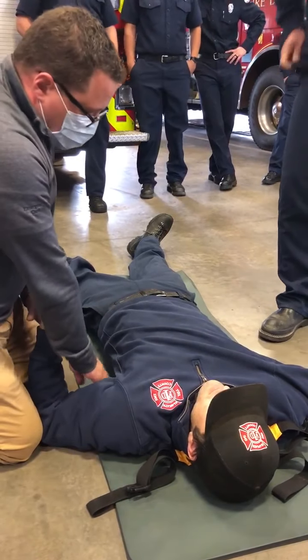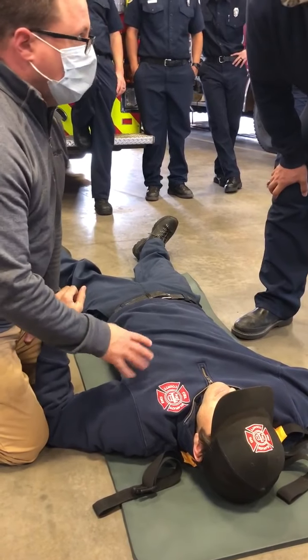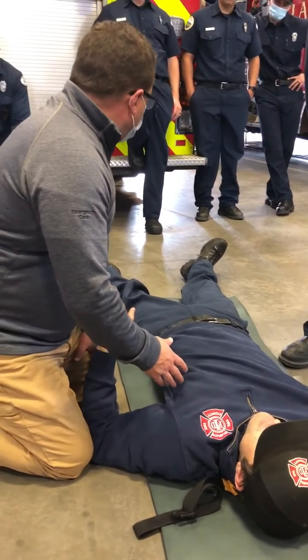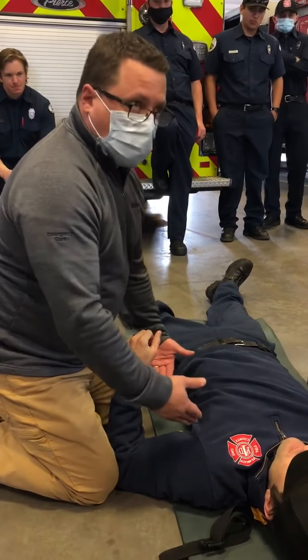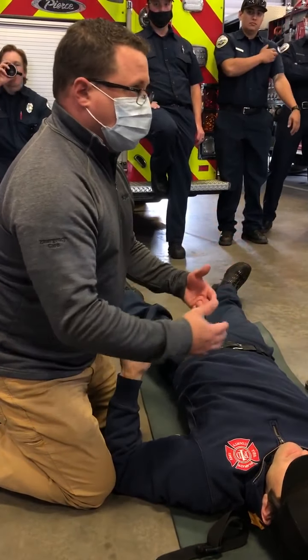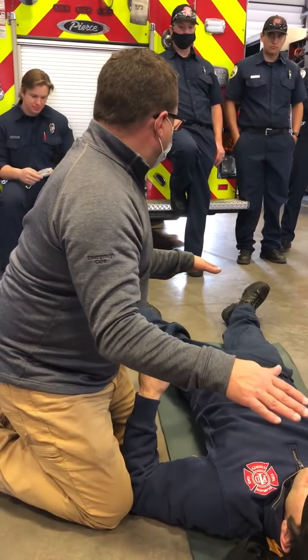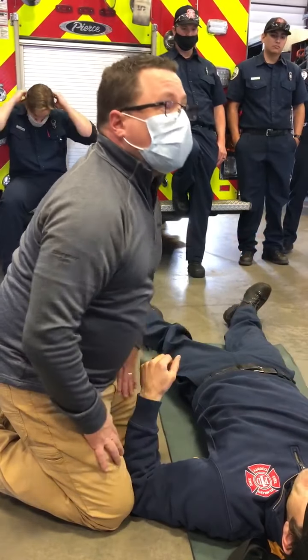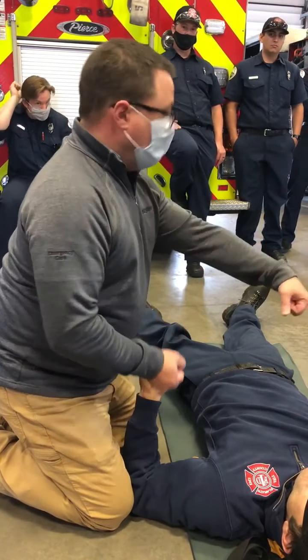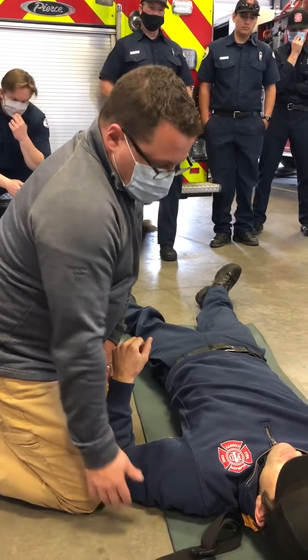Now, with that being said, look at the back plate. He's alive. He's just, you know, Narcan maybe not kicking in as fast as we want it to. As we go to do those things, just back plate him now, with the anticipation that if I have to start doing compressions and I'm on a mattress of any kind, my performance is automatically decreased. So I need to think, man, how do I get Lucas on as fast as I can? With it open like that, you can do a really, really good job. Yeah. Great job, man. Okay, go.